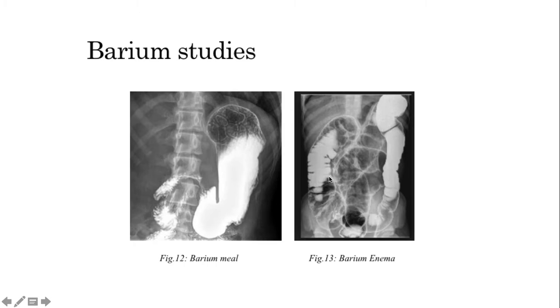They are called haustrations. This is one distinct feature of the large bowel anatomically, which are the haustrations. So in that way you can easily locate the large bowel. You can see the black shadow here. This is negative contrast. I said that the barium is radio-opaque, so what is against radio-opaque is radiolucent. Radio-opaque indicates high density, radiolucent indicates low density. Radiolucent is usually pertaining to bowel gas.